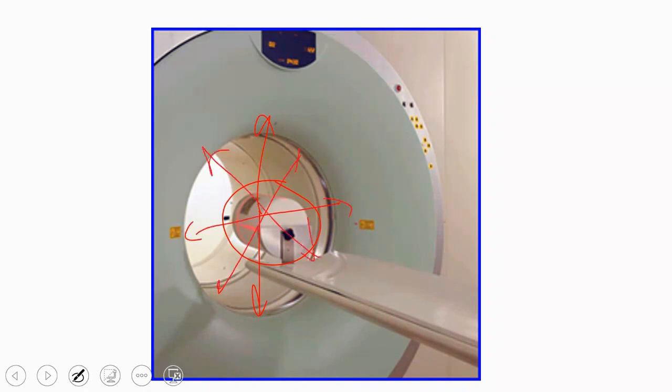Why am I doing this? I want to check the efficiency of my detectors to see if they are all working with the same efficiency, or if there is variation among the detectors or the crystals. If there is variation, it is very likely that there will be a fluctuation, and you need to deal with the electronics. This fluctuation requires a correction factor. How do I apply the correction factor? Each line of response is present, and I have detected it. This line is what I call the line of response.